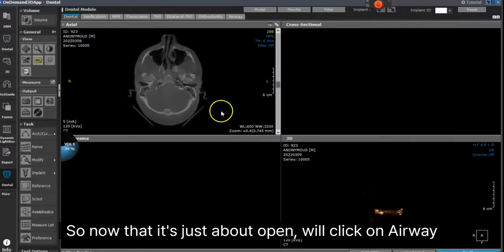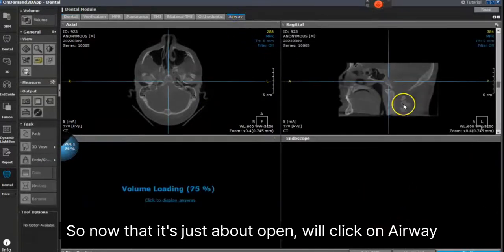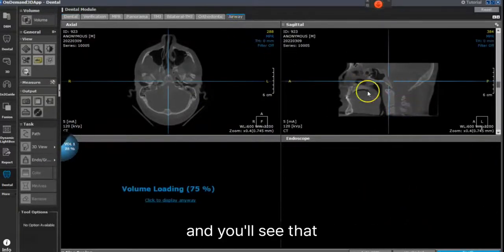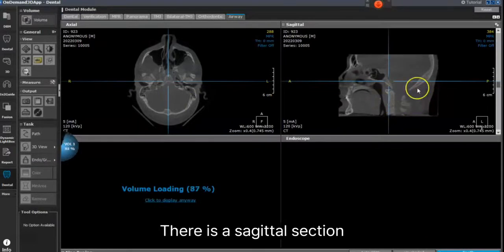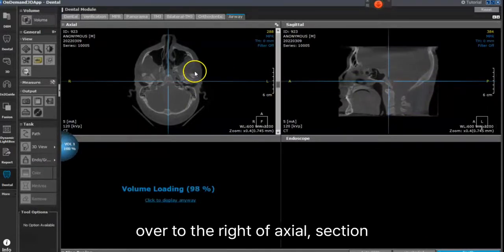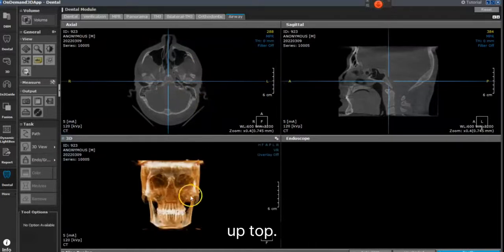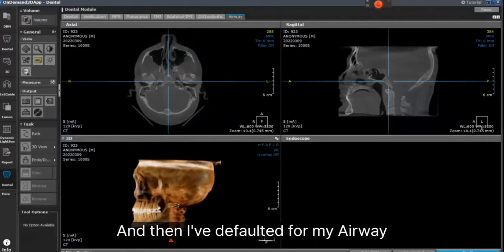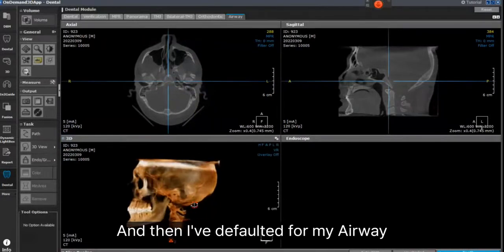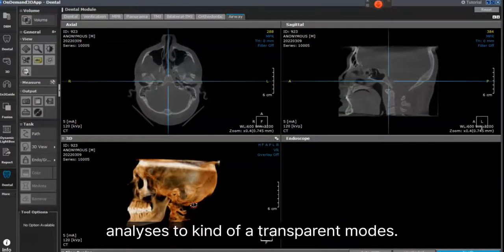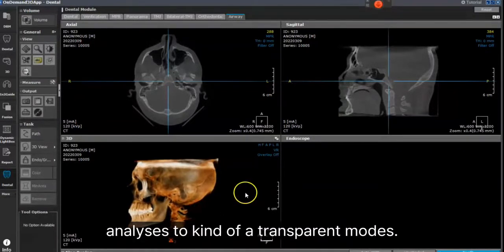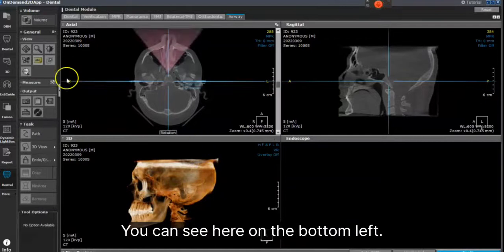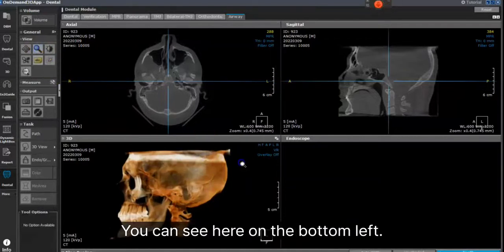Now that it's just about open, we'll click on Airway, and you'll see that there is a sagittal section over to the right, an axial section up top. And I've defaulted for my airway analyses to a transparent mode, which you can see here on the bottom left.